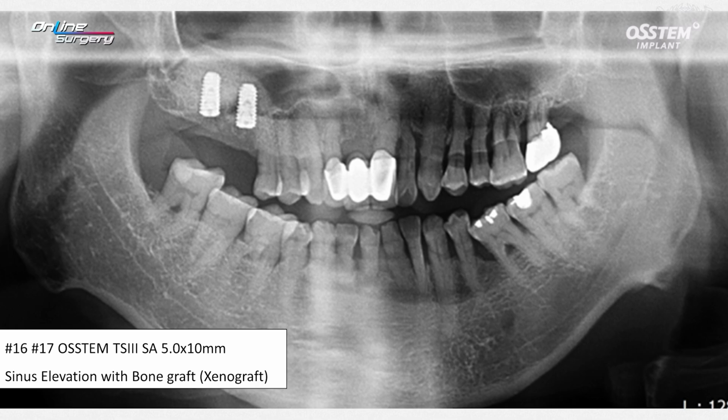At number 16 and 17, Osstem TS 5 by 10 millimeter implants, 2 of them were placed using sinus grafting with xenograft. Let's check out a video containing the surgical process explained up to now. Thank you.